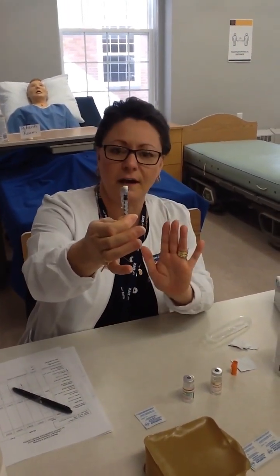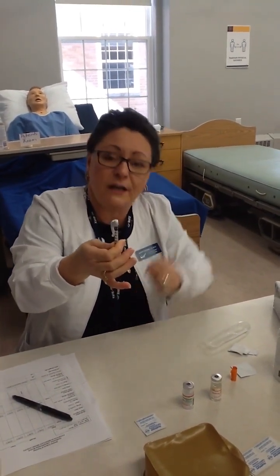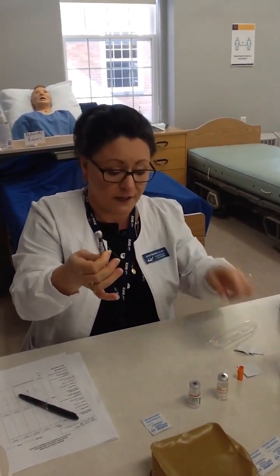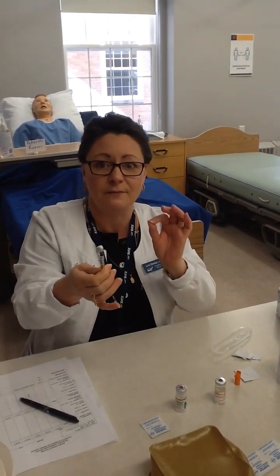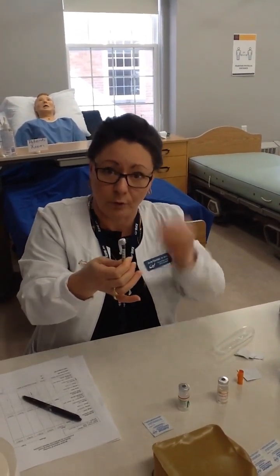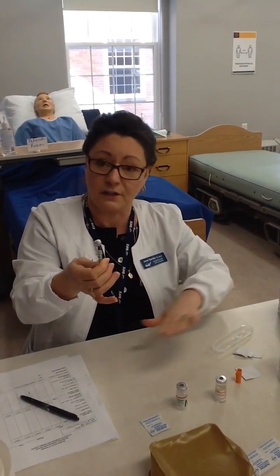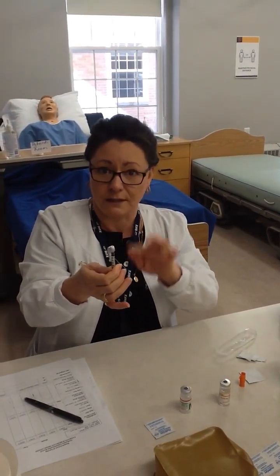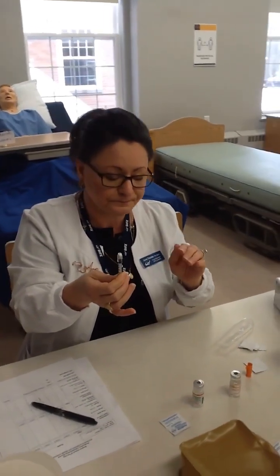So now I have 6 units. There's no air in there. That little tiny needle got primed because I pulled back a little extra and pushed back into the vial. That's fine to do with your first dose. You have not mixed anything yet. But now we're about to mix, and so you have to be very accurate with this second pullback because you can't inject anything into the vial. That would change the concentration of everything. It would change the concentration in your syringe. You'd have to discard and start over.